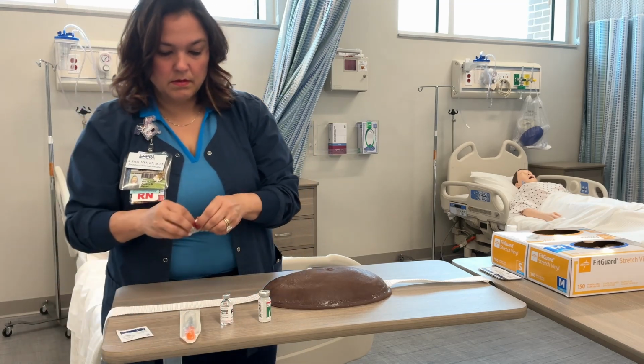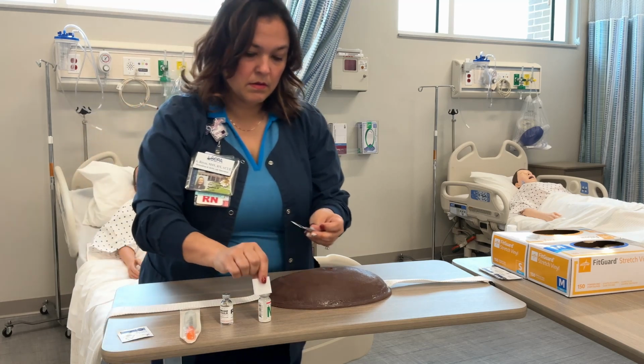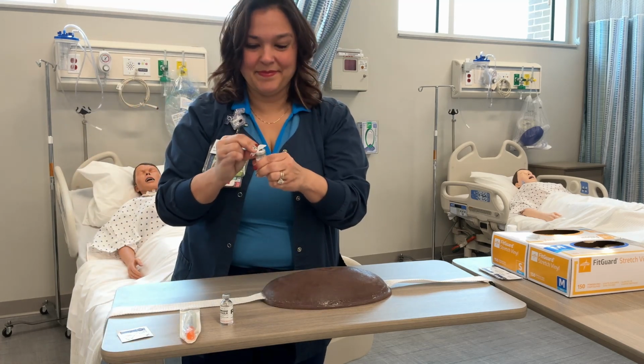All right, so once we've cleaned those, we're going to, sorry. You're fine.